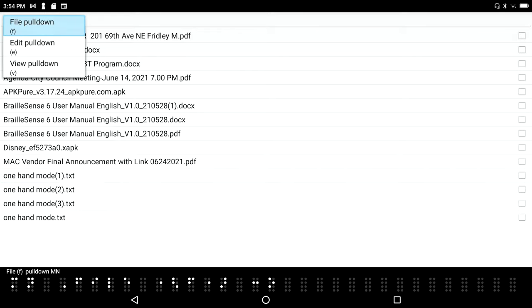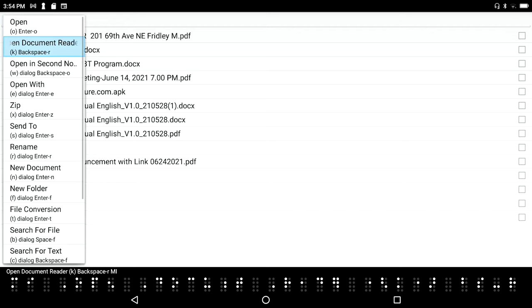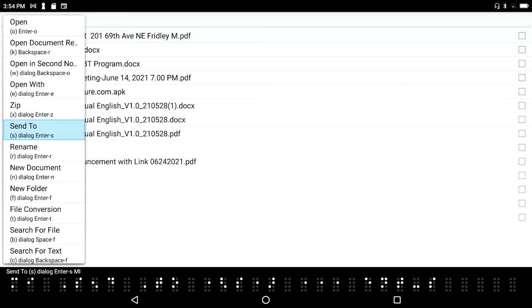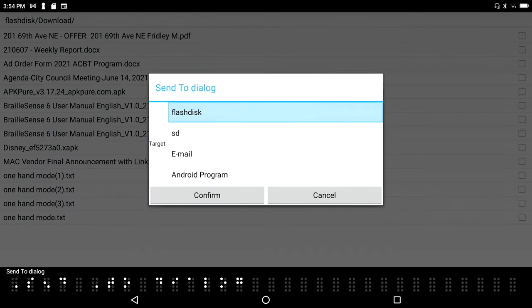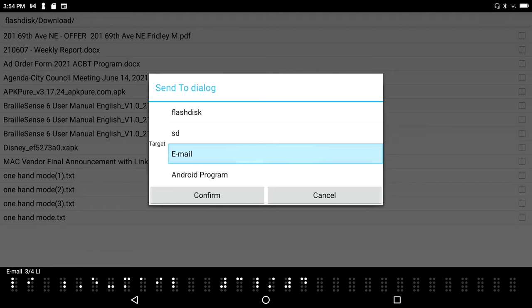File pull down menu, and I want to go into the file pull down menu. I'll go down through here until I come across 'Send to'. So I'll press enter on send to. Send to dialog. Target flash disk or email. I'm going to choose email.